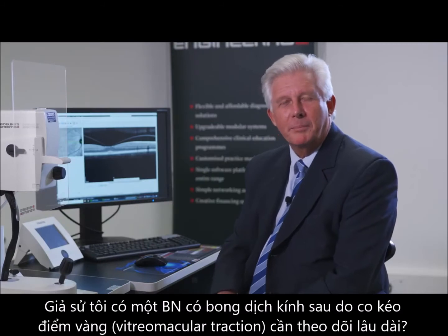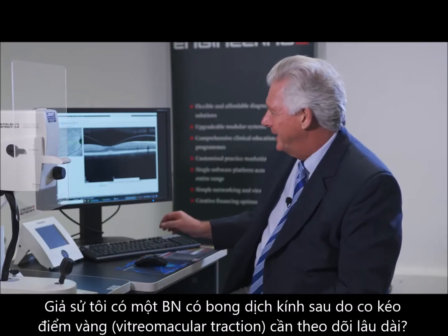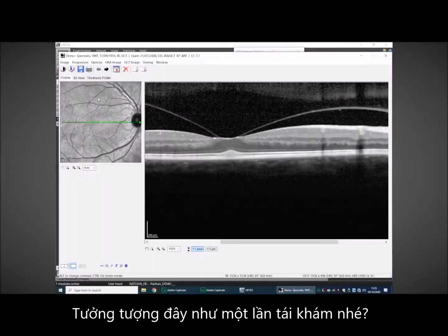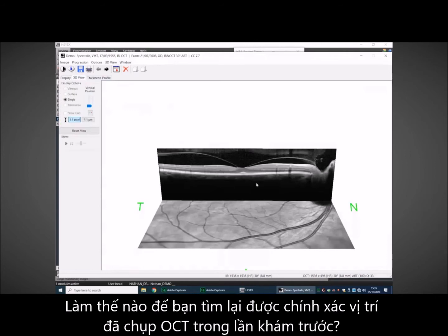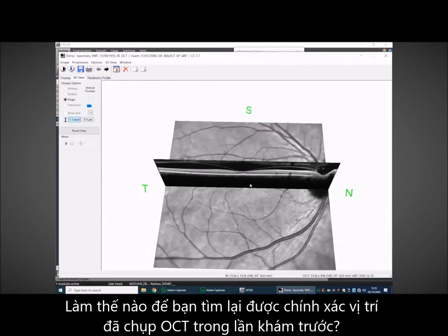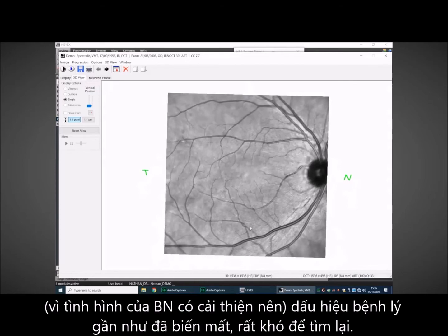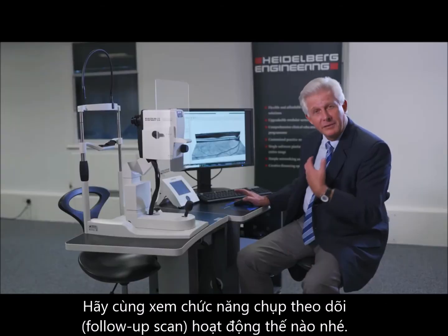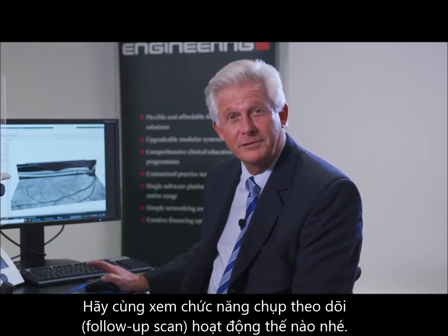So let's come back to our patient with the vitreomacular traction and think about the follow-up. So, first of all, how are you going to come back to exactly the same location with your OCT? You can see that disappears. It's pretty tricky, right? So let's look at a follow-up scan and see how that works.